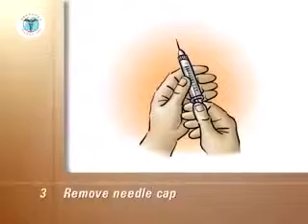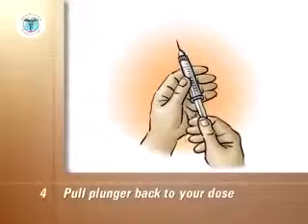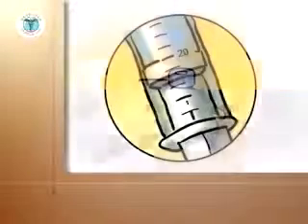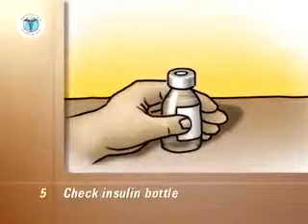With the syringe held upright, pull the plunger back until the end of the plunger is at the mark of your dose, which in this example is 20 units. There is now air in the syringe. Check the insulin bottle to ensure you have the correct type of insulin.